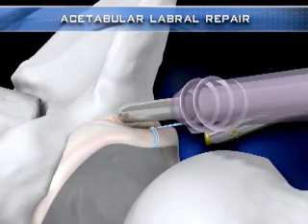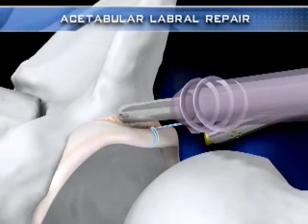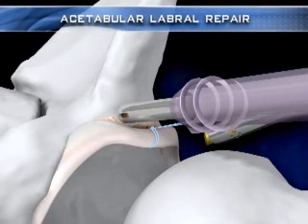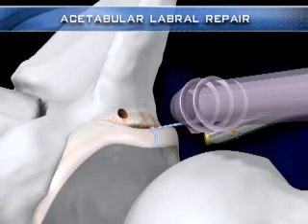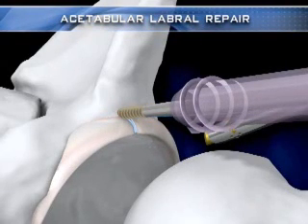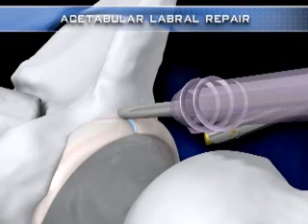A hip pushlock spear and drill are then utilized to create a socket for the knotless pushlock anchor. The anchor is then slid down the tails of the cinch stitch and placed into the socket prior to impaction to check tissue tension. Impacting the plunger on the back of the pushlock handle advances the anchor into the socket without further tensioning suture tails or tissue.